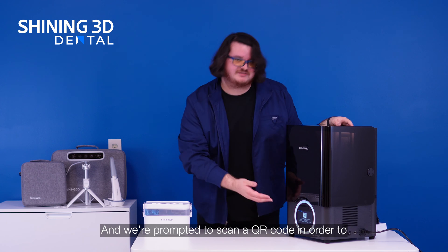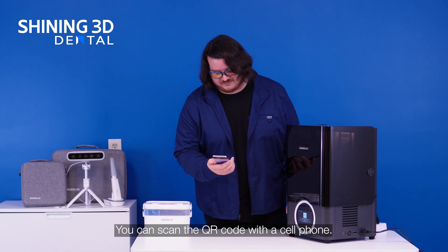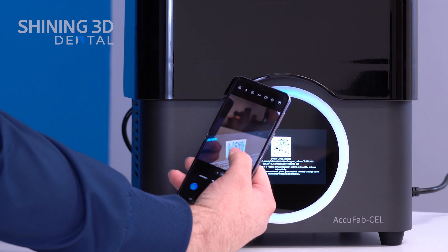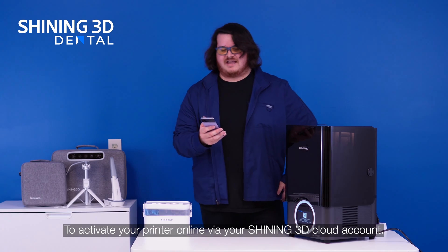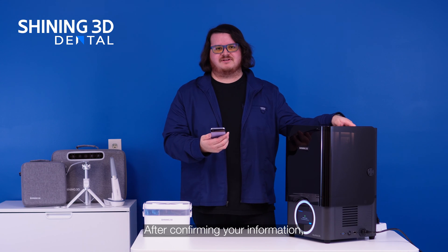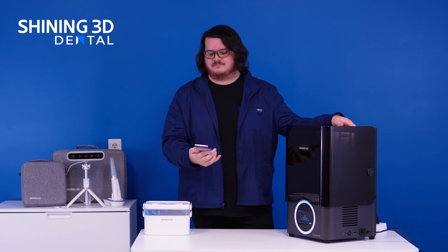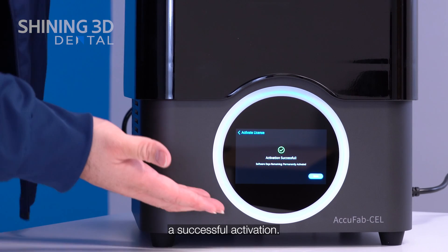We're prompted to scan a QR code in order to activate our printer. You can scan the QR code with a cell phone to activate your printer online via your Shining3D cloud account. After confirming your information, you'll get an activation message and the printer will show a successful activation.